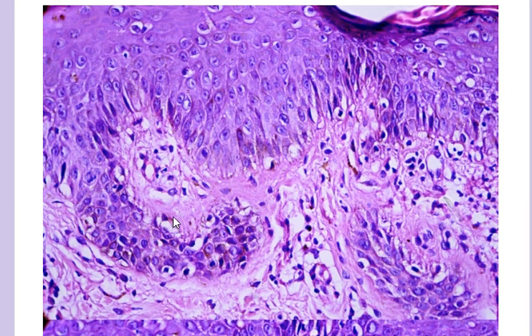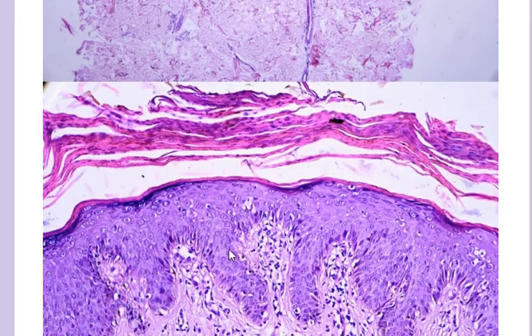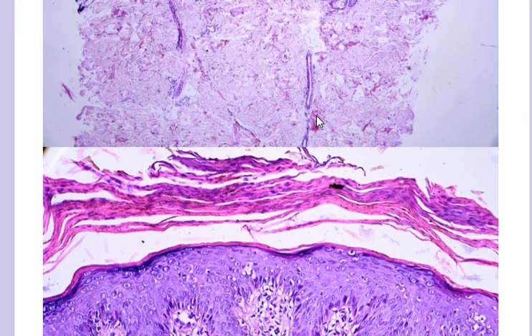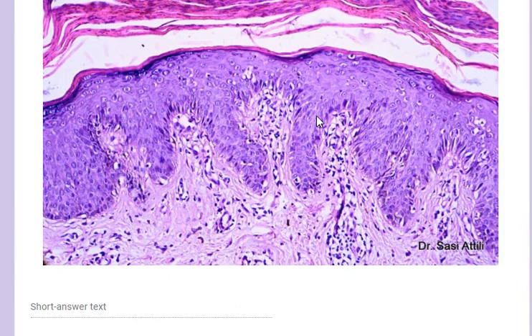Though this is a commonly laughed-at statement in histological reports, unless you correlate clinically and histopathologically, you cannot make a diagnosis in most cases. If I was given just this histology without any clinical information, and I put parapsoriasis in the differential diagnosis, it would have become very difficult.